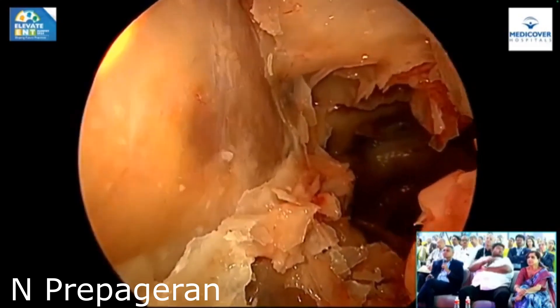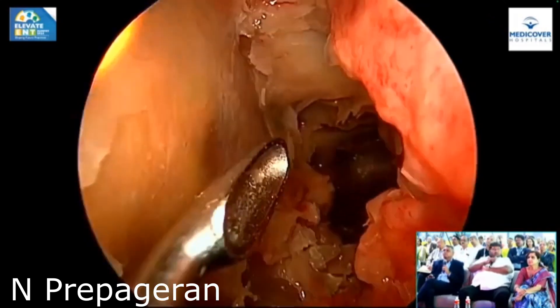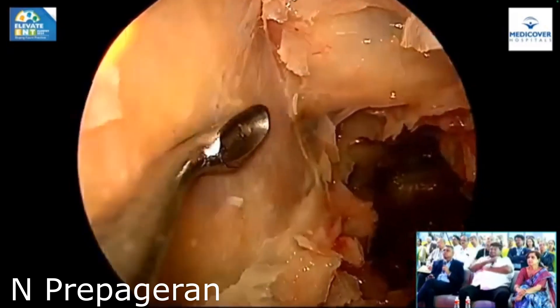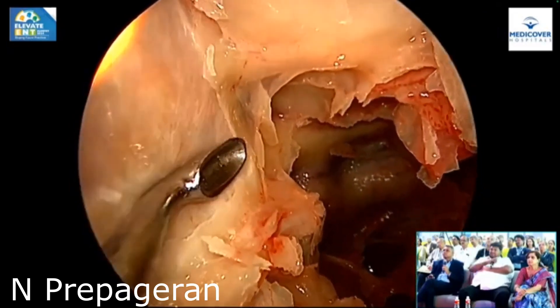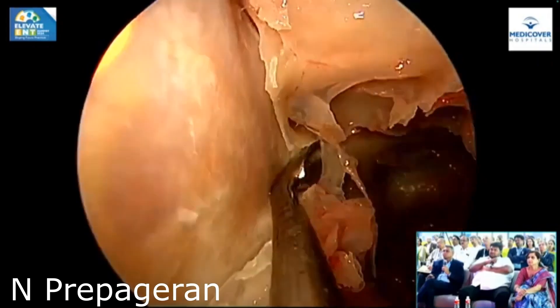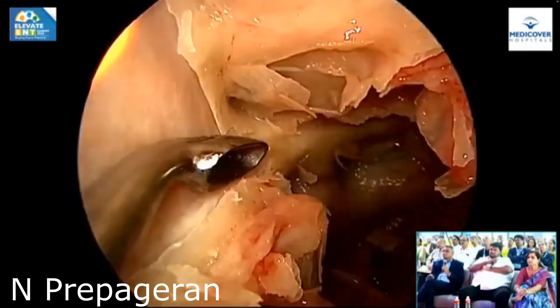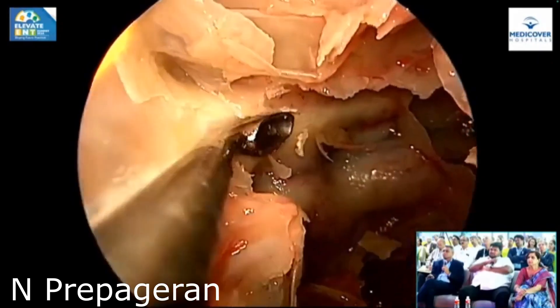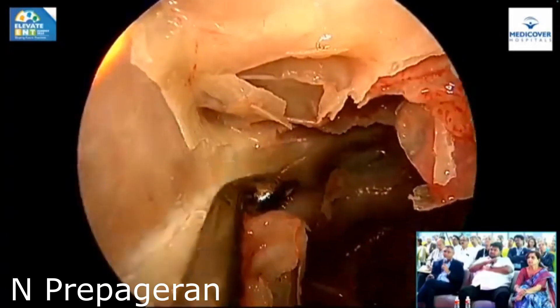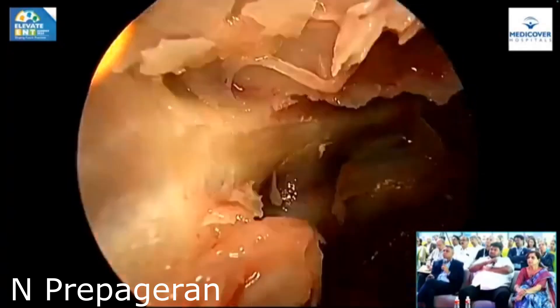Now we're using the fourth instrument: the curette. To do optic nerve decompression, you put a curette in and you can just dissect the bone away. That's optic nerve decompression being done, and this is what I'm doing now. The entire dissection is exactly what I do at home.